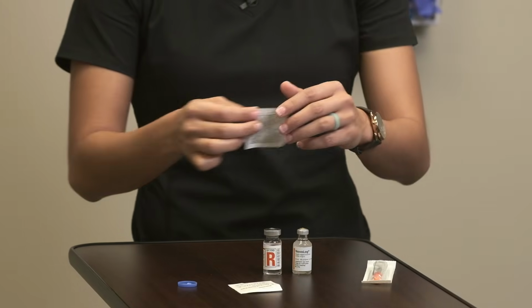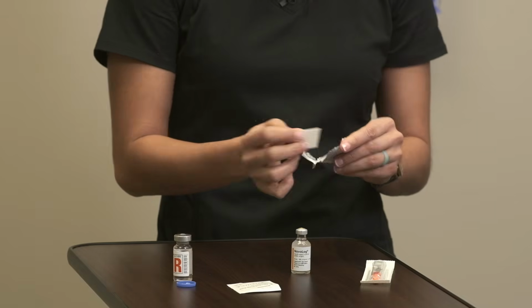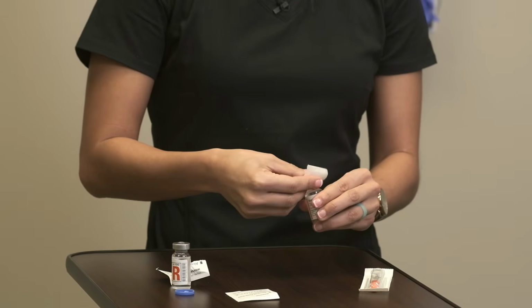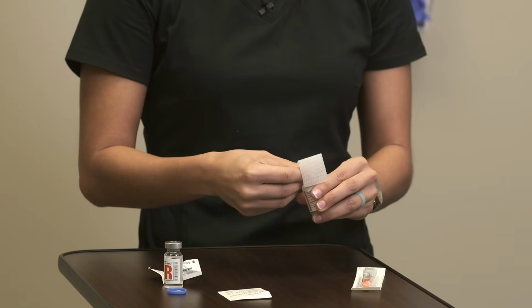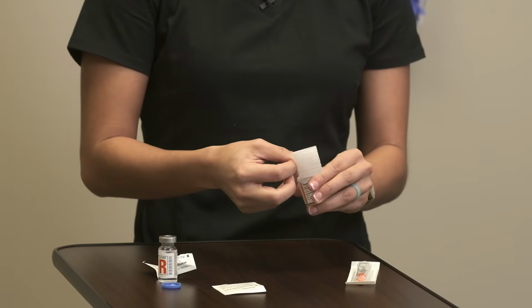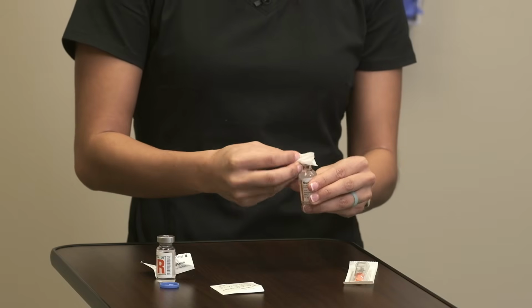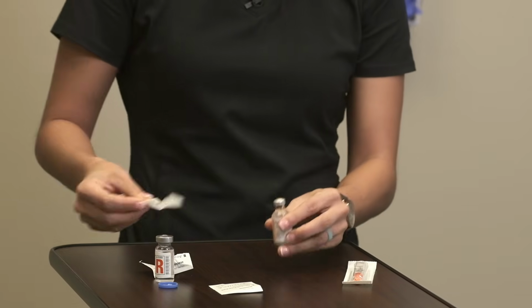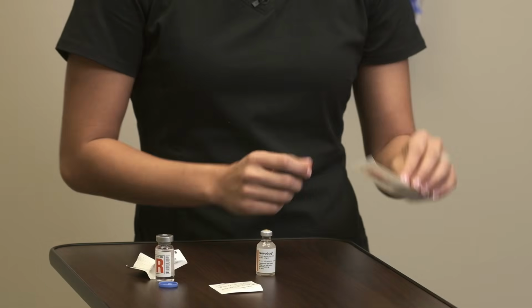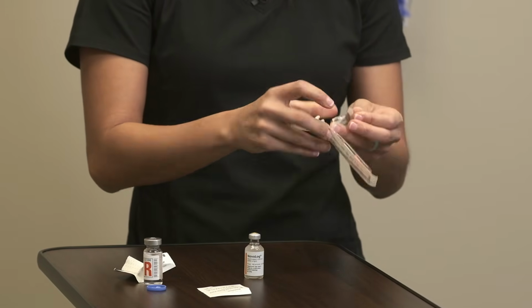I'm just going to take an alcohol pad, and we're going to use this one for today. Remember, even if the cap was on, I would still clean the vial. There could be dirt, there could be debris. We want to clean this off before we put our needle in. So I just take my alcohol and rub this vigorously, clean off this top, and let that dry. Now I'm going to take my needle, open this up.